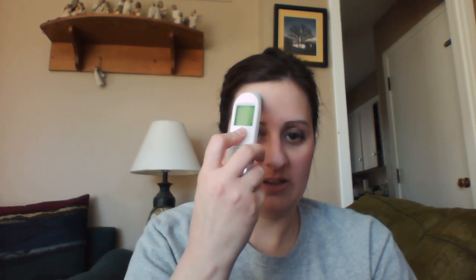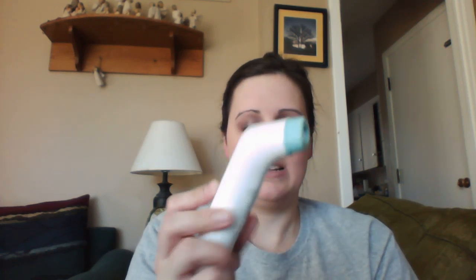So it works really easily. This is what the back looks like. You just turn it on and it lights up, and then once it goes to all dashes or to all zeros, you just put it right above your eyebrow. Hold down the button while you scan to your temple and back. The long beep tells you that you're done — and I am 98.7 right now.